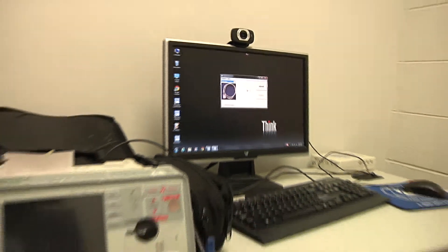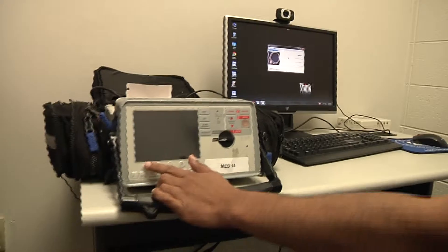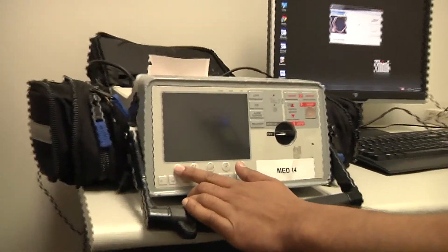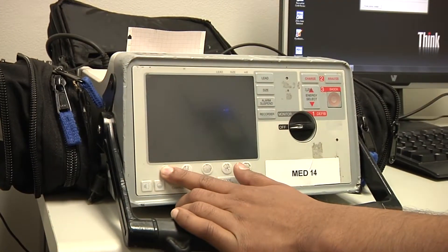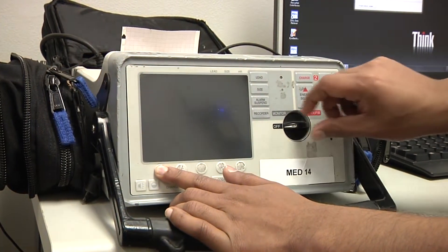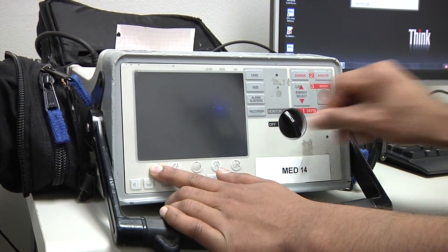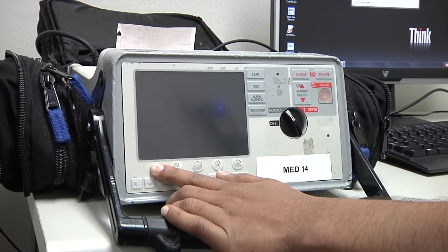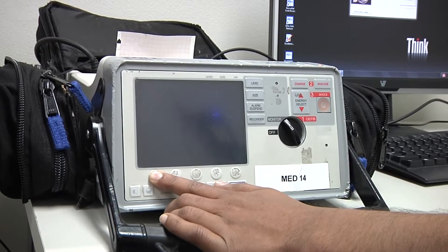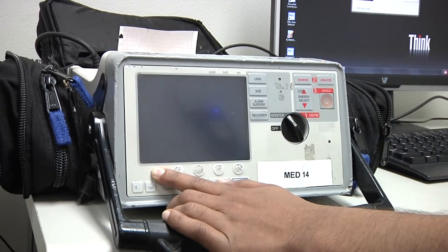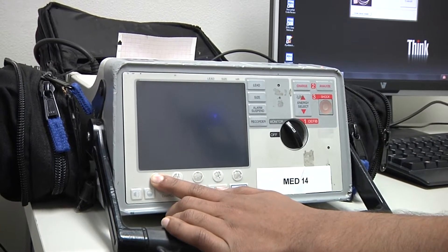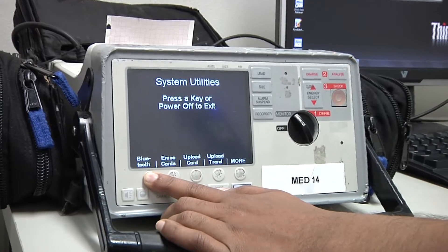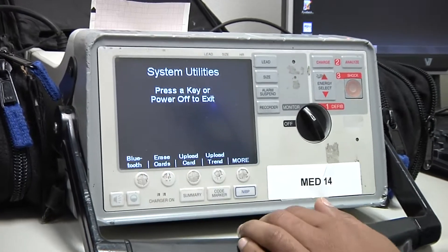Next, I'm going to come over to my monitor and press the leftmost soft key. Hold that down while I flip the monitor on with the monitor switch, still holding the soft key until the system utilities display appears, and then I can release.